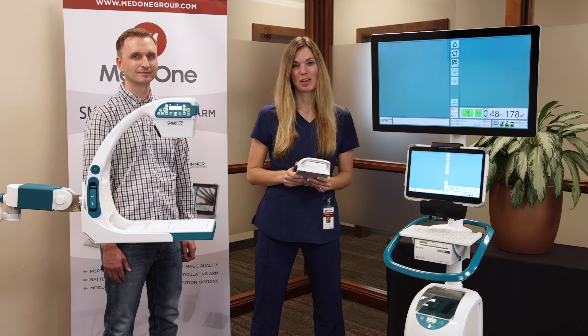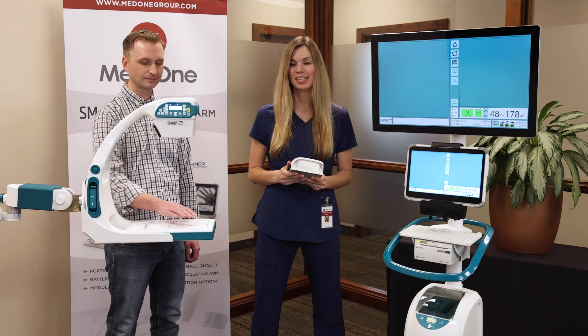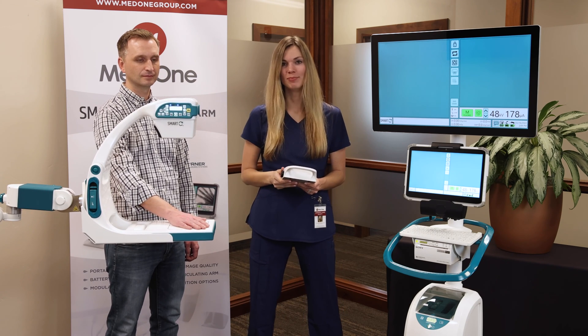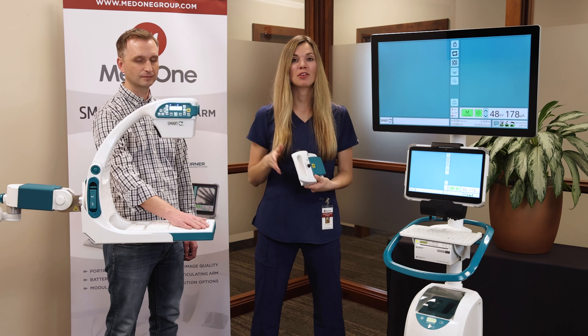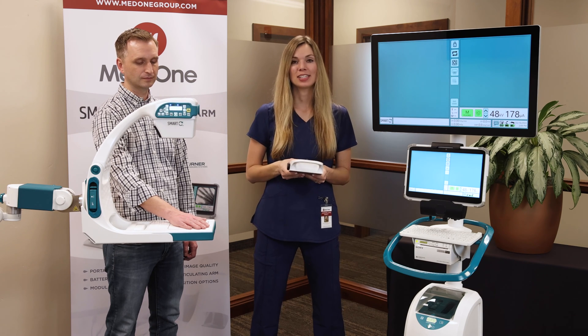Now we're ready to take an image. Position the Smart-C and your patient into the desired position. There's also a laser function to help with positioning. To take an image, you have a few different options — there are three different buttons on the head of the Smart-C, or you have the foot pedal. Simply press and hold down the button to initiate an image and release to terminate.